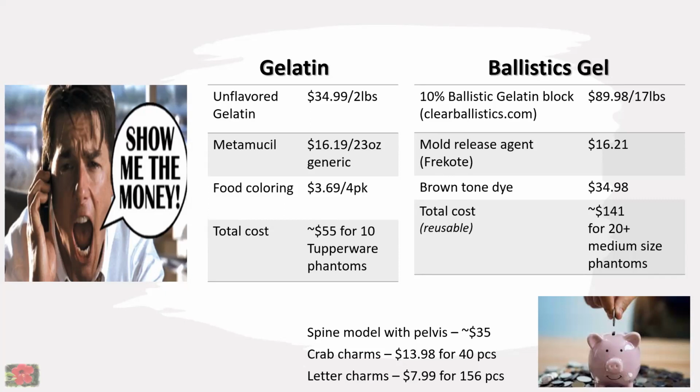And it's super cool because I've learned so much from Mona doing this, where she uses a little bit of that ballistics gel and then puts it sometimes at the edge of the phantom, right, Mona? And then you can melt it to even close off one side and then fill the fluid with the other. For the gelatin ones, I will say that the bladder one, for instance, is just enclosed in the balloon. And because the gelatin phantoms don't really last for me past a couple of sessions, I usually don't need to refill it because I tend to just remake it.